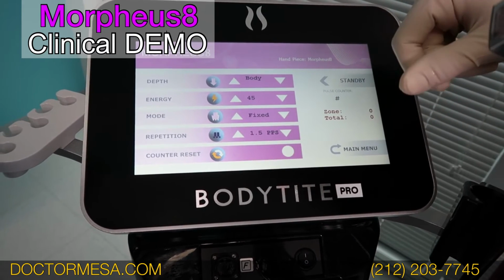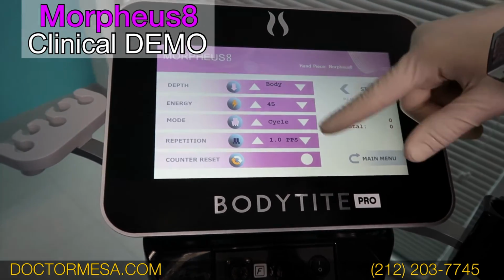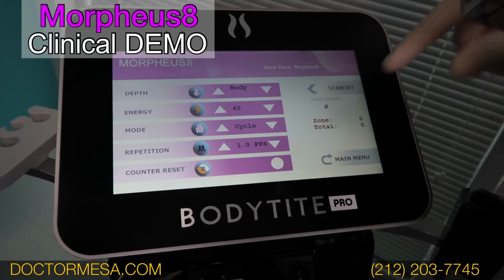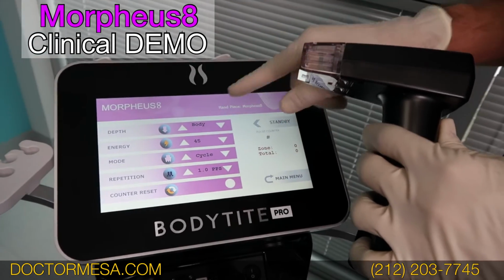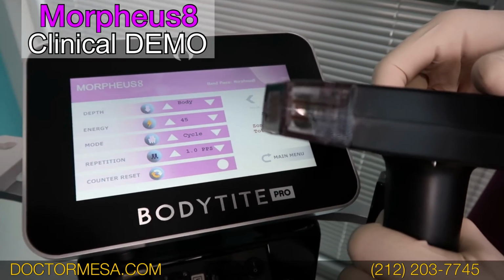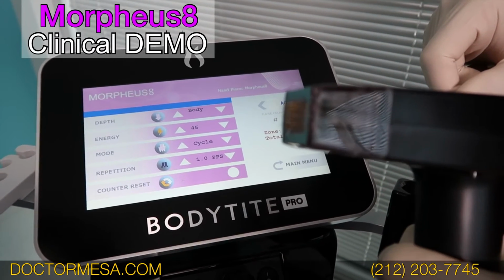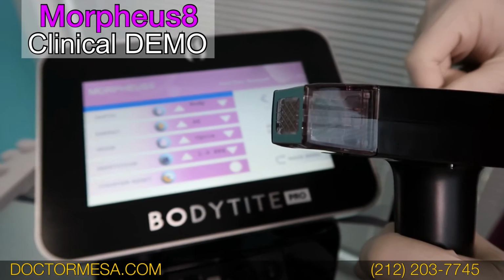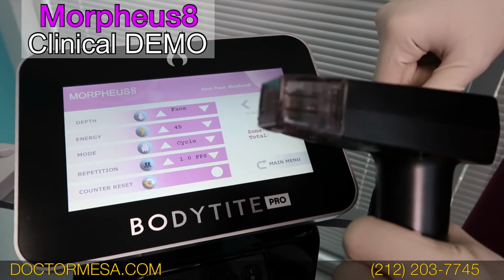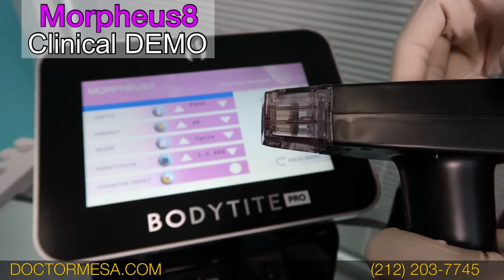And there are 2 different modes. There is the fix and the cycle. This decides if the needles are going to go in and out, and the speed of the treatment. So I'm going to show you right now how the cycle works for the body. That is the one that melts the fat away. So let's check the needles here, and then I'm going to press. I'm going to put it on ready, and you see the needles come in and out. This is what the Fractora is. But then when we put it in a different setting like the face, and we put the device on ready, the needles come out a little bit less, and that's what does the skin tightening.